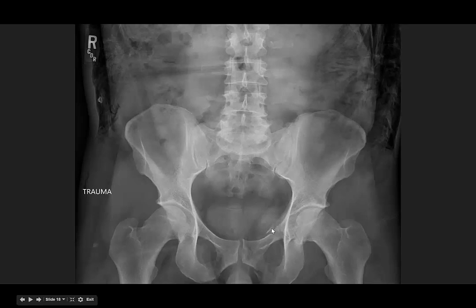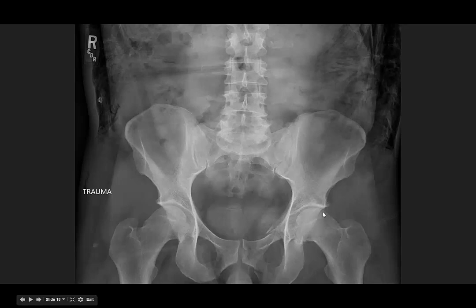A very large superior pubic rami fracture. You look on the inner portion of the ring — pubic rami fracture — and then check the other side: an inferior pubic rami fracture there as well. The inferior portion we already found. This side actually looks okay. Inside of the ring, check your posterior acetabulum — that's this line right here — as well as your acetabular cup. This one's subtle; I'm not sure you can see it very well on the plain film, but you can see it on the follow-up CT. These small bony fragments here represent a possible posterior acetabular fracture.